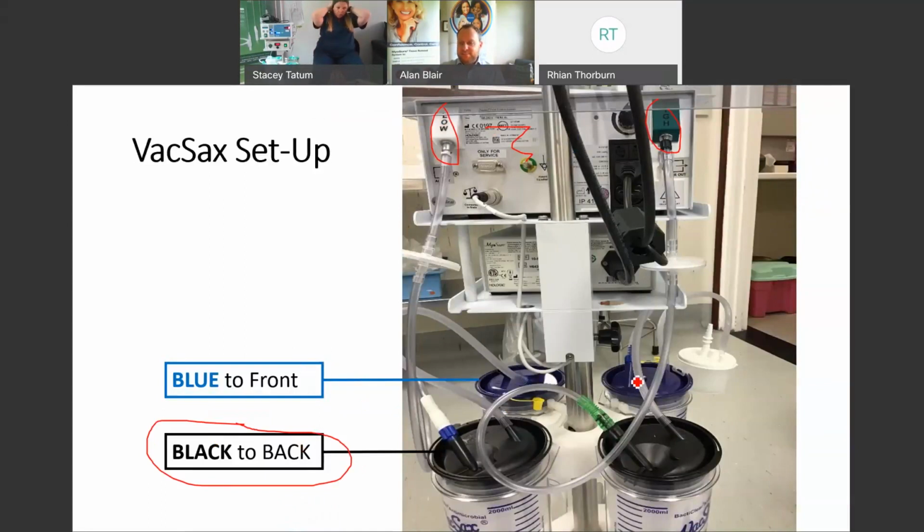It's exactly the same system as I described before, in the sense that your blue will fill up first, and then any overflow will run through on the tandem tubing into the back here. So you can see here, it would flow up through here and then start to fill in the back canister here. And also just to show you that from the high suction side here, we have got air. This is just air being sucked by the machine. The Aquilex machine is sucking air to create that vacuum into the canister. So air is being pulled back and up and out the machine in that direction.